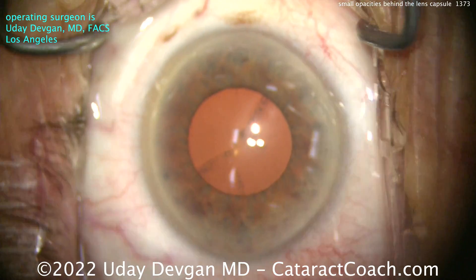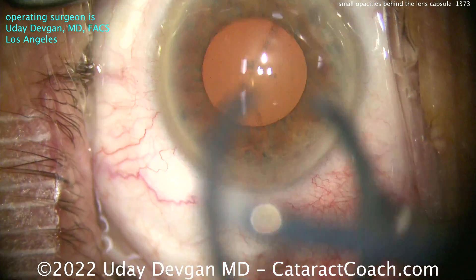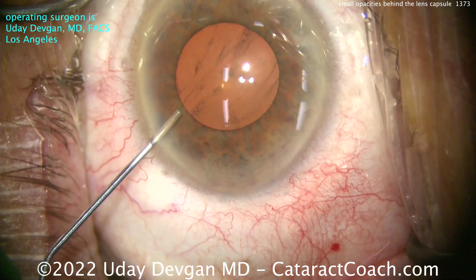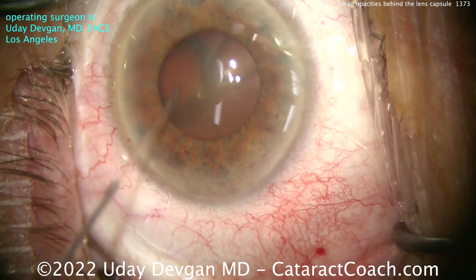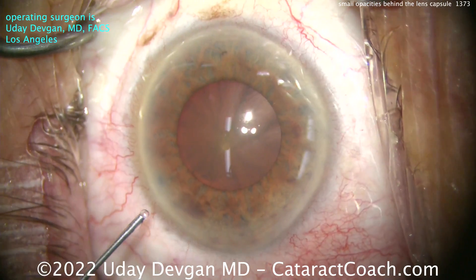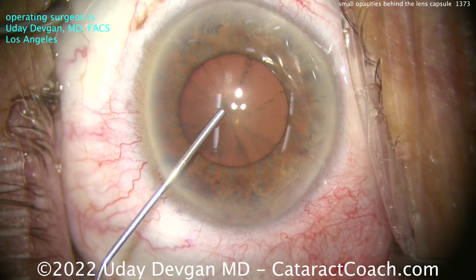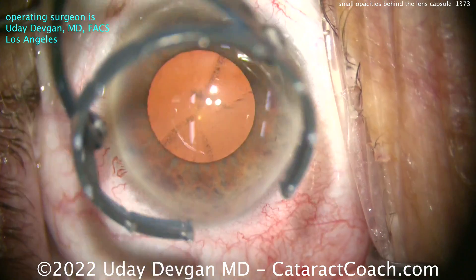I'm going to show you a complete cataract case. This is me operating on a routine cataract — setting up our speculum, getting the eye in position. Dilation is probably about 4.5 to 5 millimeters, pretty reasonable. We'll make our paracentesis here. This patient has a pretty reasonable cataract, probably 2 to 3 plus nucleus sclerosis. I'm stealing some anesthetic here — just some lidocaine — trying to get it under the pupil to expand it a little bit more. What's going to be different in this case is we're going to see some opacities behind the posterior capsule. So doing some viscomydriasis, we're going to get that pupil slightly more expanded. There's a pretty good red reflex, and the pupil is about 5, maybe even 5.5 millimeters, temporarily until we lose the viscoelastic.